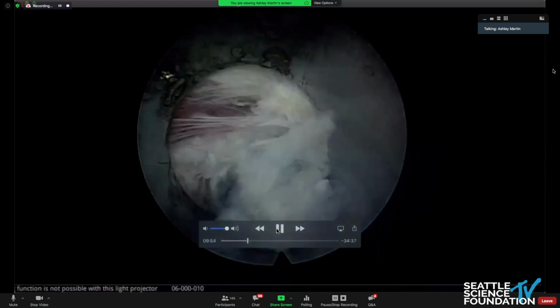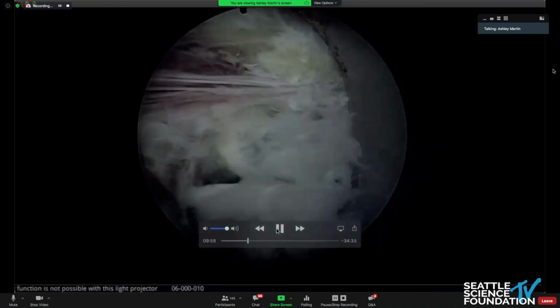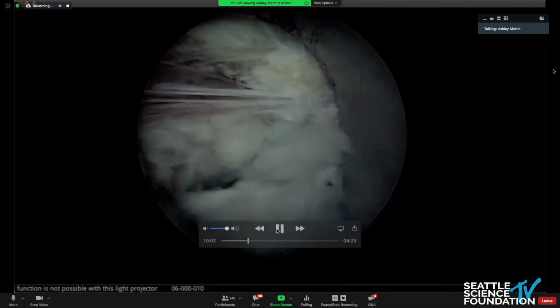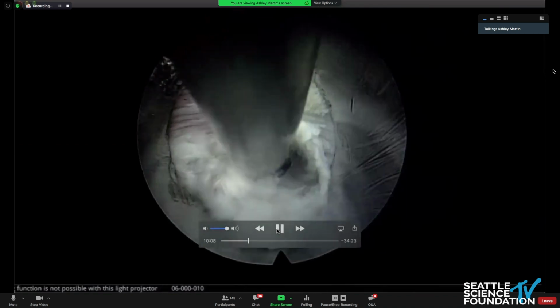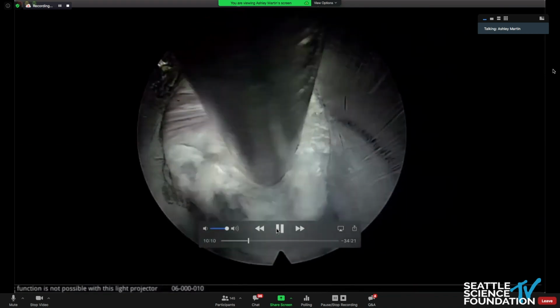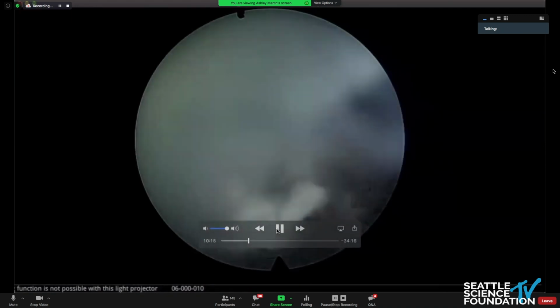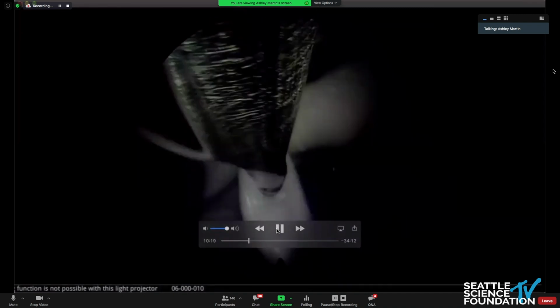Pull out any fragments. So this is a good view. This is showing there's some posterior annulus. You can see the white parts, and then there's part of the epidural space. You can see some epidural vessels, the red stuff, and then maybe the lateral extent of the ligament of flavum up at 1 o'clock. You see the yellow stuff. So here's some of the herniation, part of the foraminal herniation.